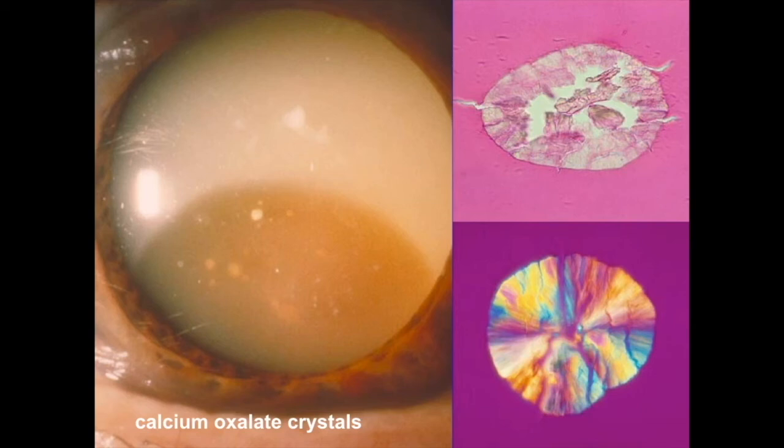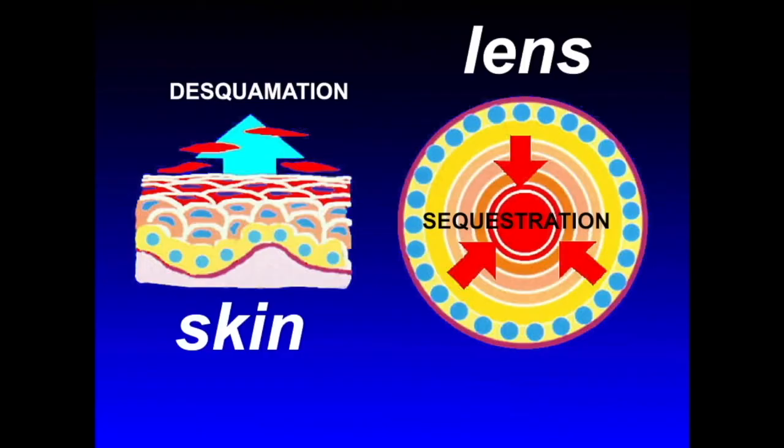Under higher magnification, we look at the sclerotic lens nucleus here, and we can see multiple little lighter round areas. These correspond to calcium oxalate crystals, which can be associated with severe nuclear sclerosis. Here's an example of florid calcium oxalate crystals. One of our residents was doing cataract surgery over in Camden and had some problems with a sclerotic nucleus. This was removed and submitted to pathology, and it was just absolutely loaded with oxalate crystals.